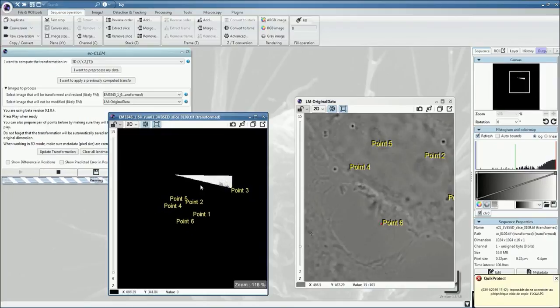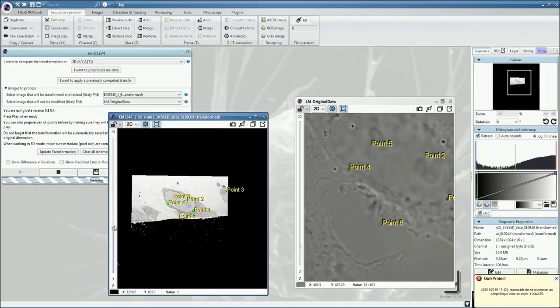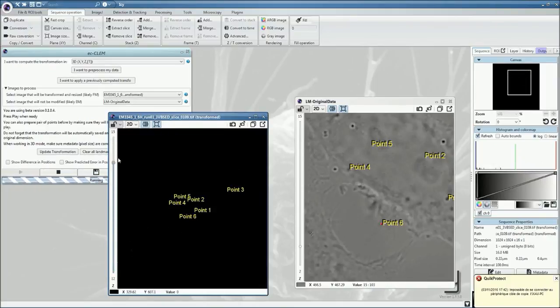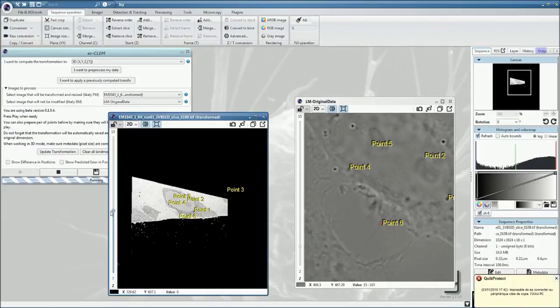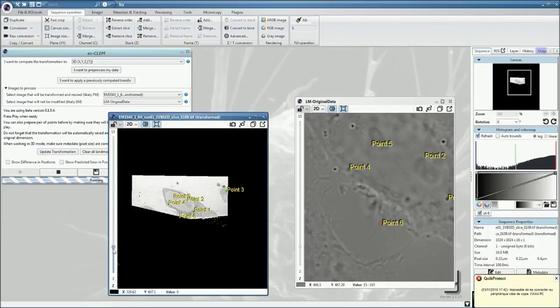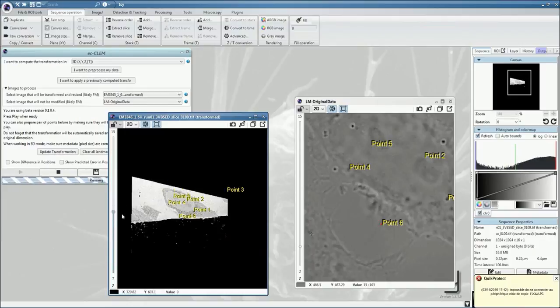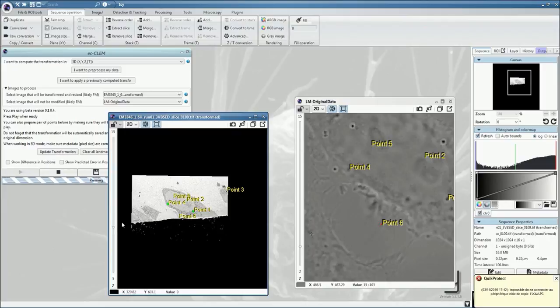Now the calculation is processed, and as you can see, it's already starting to display. The Z-stack has been processed in 3D, and therefore your section is now aligned to the fluorescence micrograph.